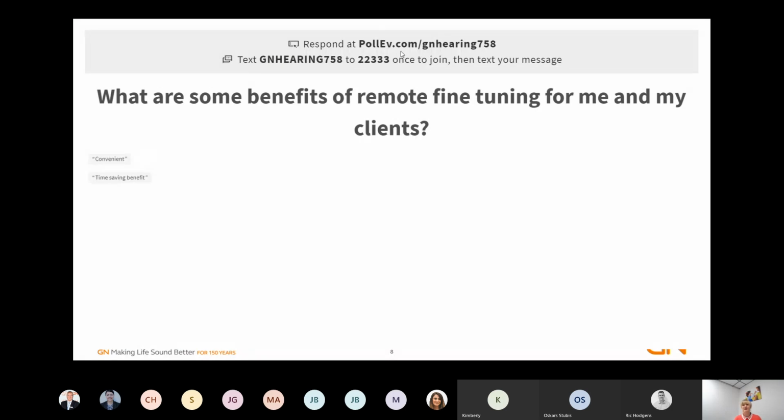Yeah, it's convenient, perfect. Yeah, it can be done anywhere rather than them having to travel maybe 2 or 3 hours to see you. The asynchronous in particular is quite convenient and time saving because you don't even have to have an appointment time for that. We can just send the request back and forth in whatever time suits us best.